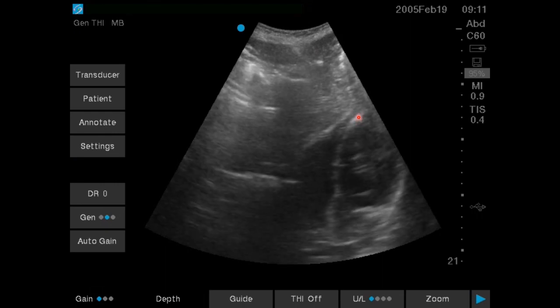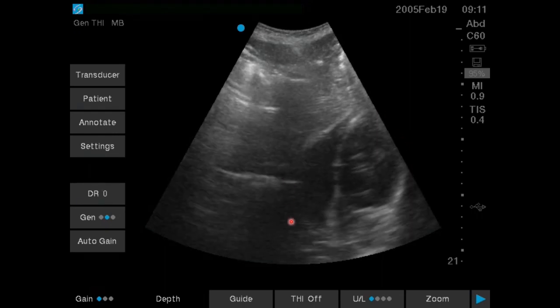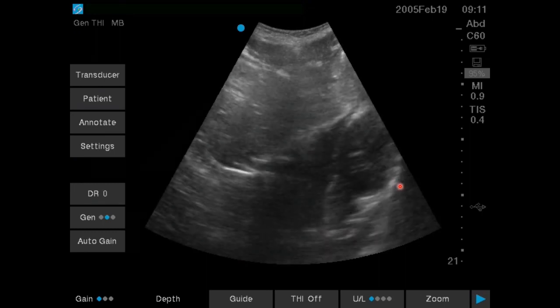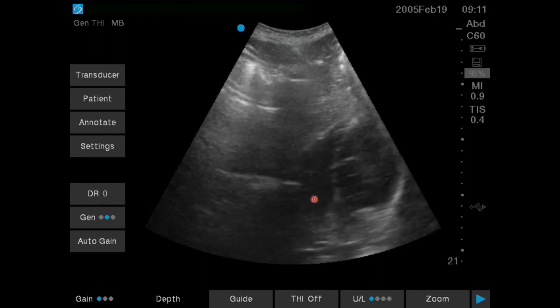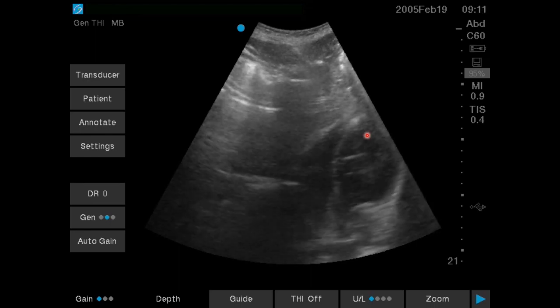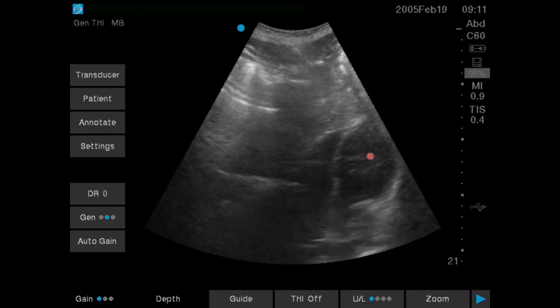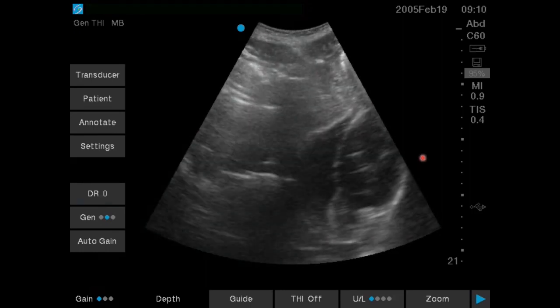The heart is mainly hyperechoic around with the fibrous pericardial sac and some musculature to it. And then inside is anechoic, right? And that's not abnormal, because inside the heart is blood. Blood is pumping. Okay, so this is what normal looks like.